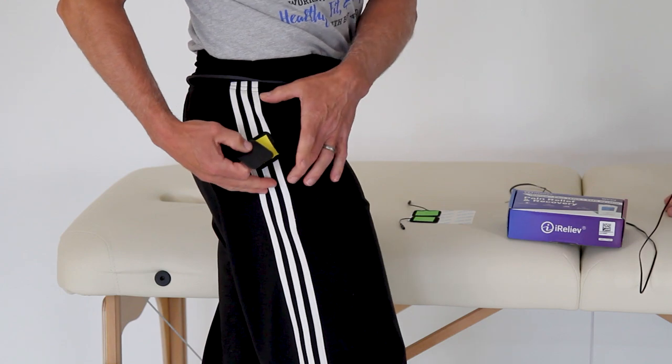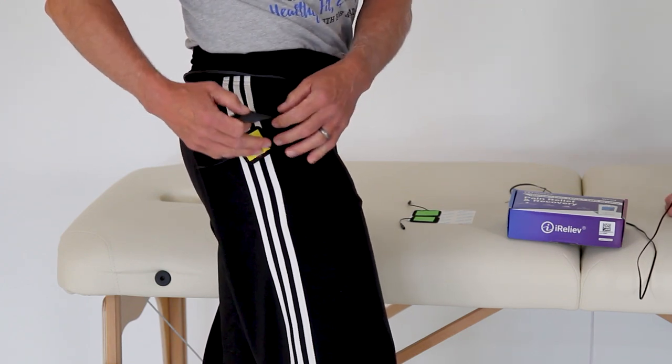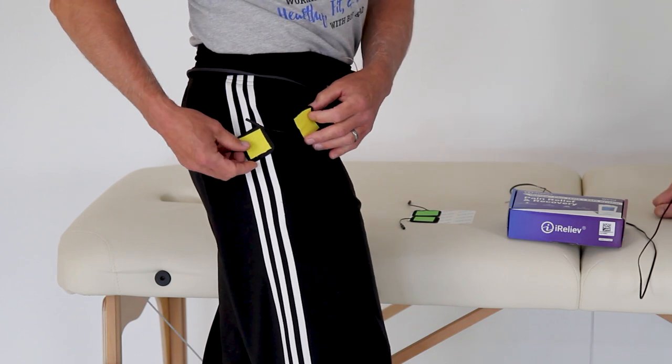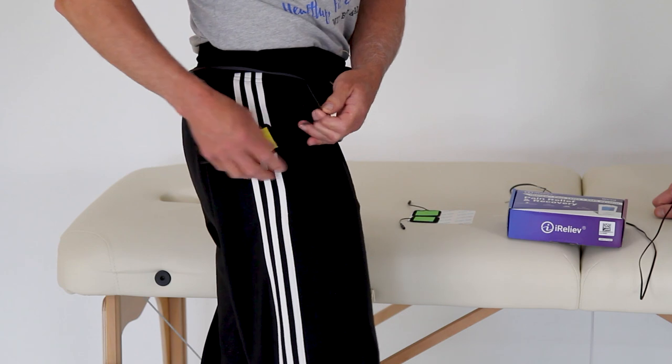So make sure your skin's very clean. Wash it with soap and water, get it very dry, and then you can go ahead. The oils from the skin can help break down the stickiness of the pads. Plus, it'll conduct better, so it lasts longer. Everything's good about it when things are clean.